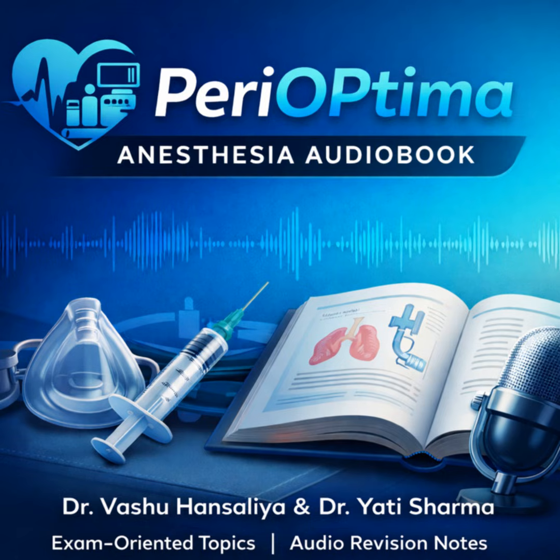Focus on quantifying the technology. The Desflurane traps are extremely popular. A common trap. What is the numerical value of the heated sump temperature in the Desflurane vaporizer? Safe answer: 39 degrees Celsius. Next trap. What is the resulting constant vapor pressure created by this heating? Safe answer: 2 atmospheres. And the subtle but important oximetry accuracy trap.